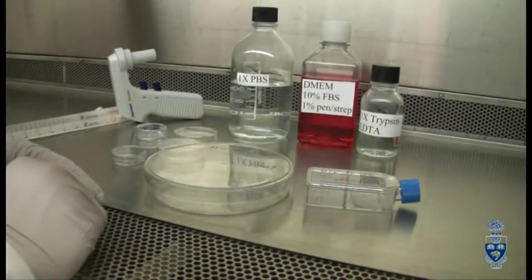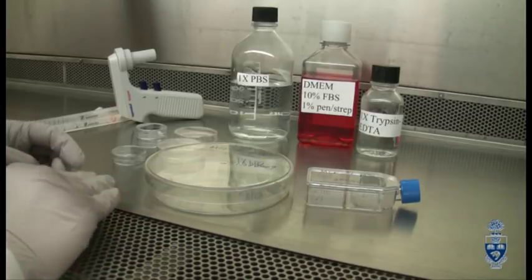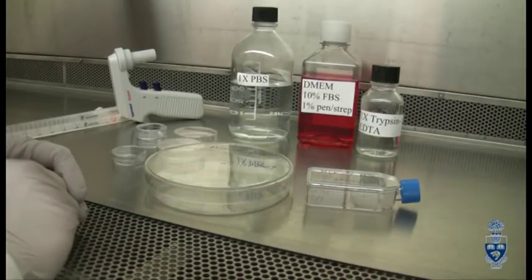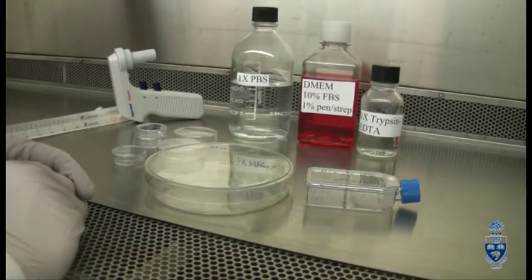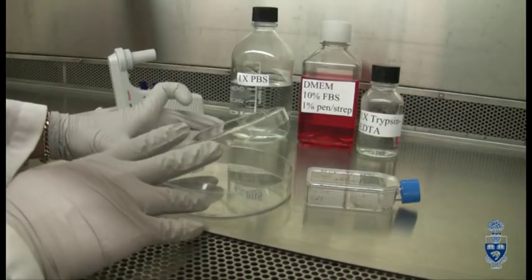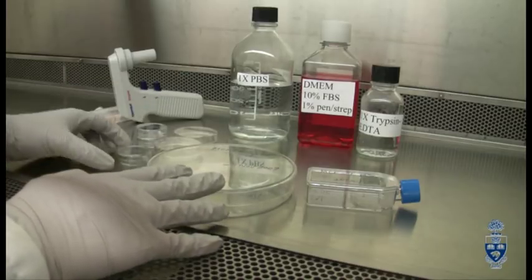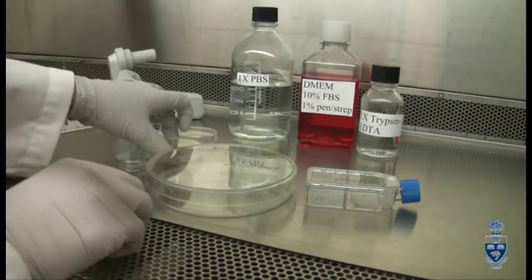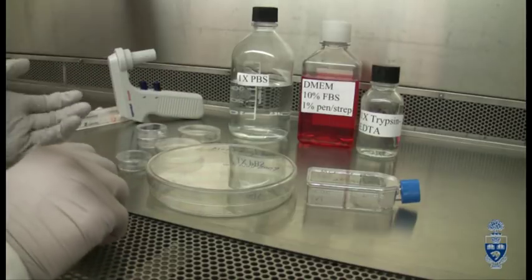The MCF7 breast cancer cell lines are adherent cells, meaning that they adhere to the bottom of the culture vessel that they are being grown in. As you can see, there are multiple examples of culture vessels. This one here is a cell culture dish. The lid comes off and there are multiple sizes that can be used depending on the nature of your experiment.